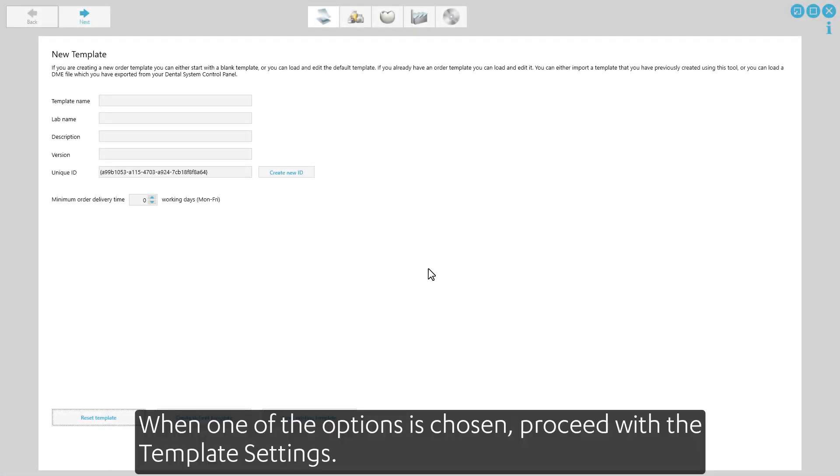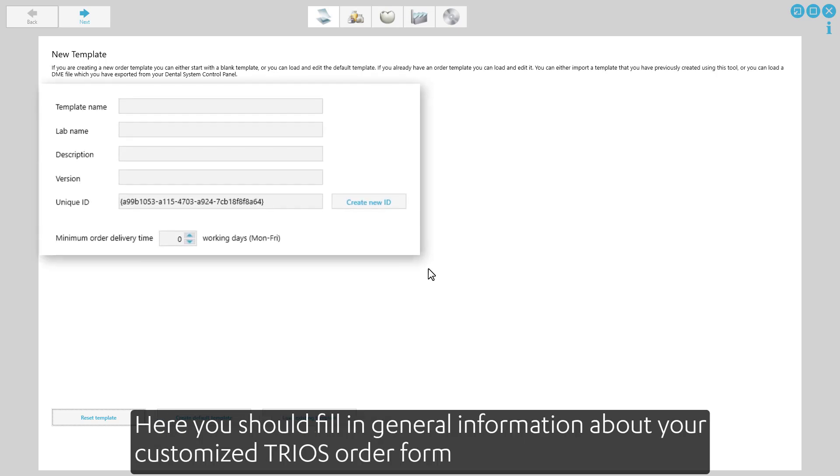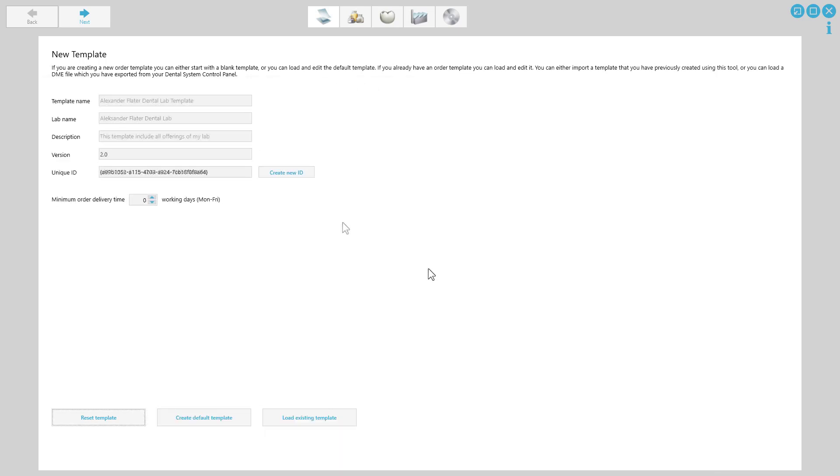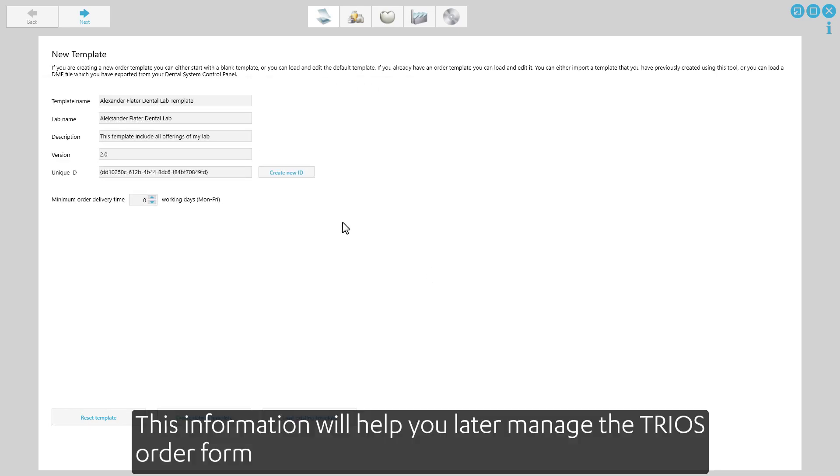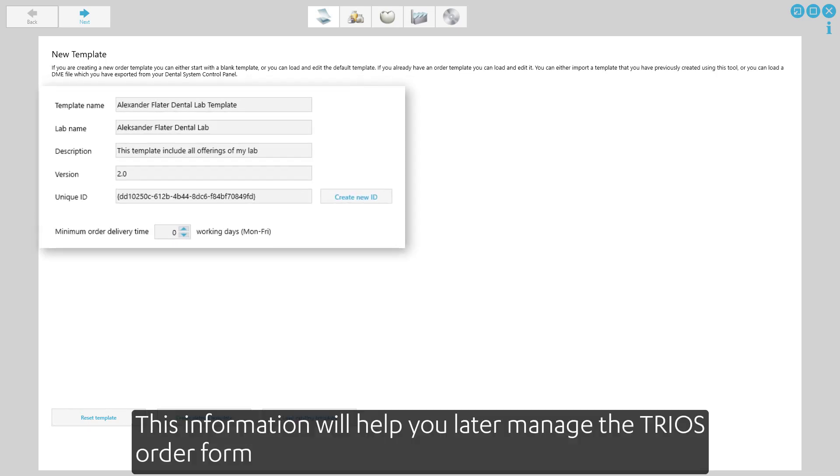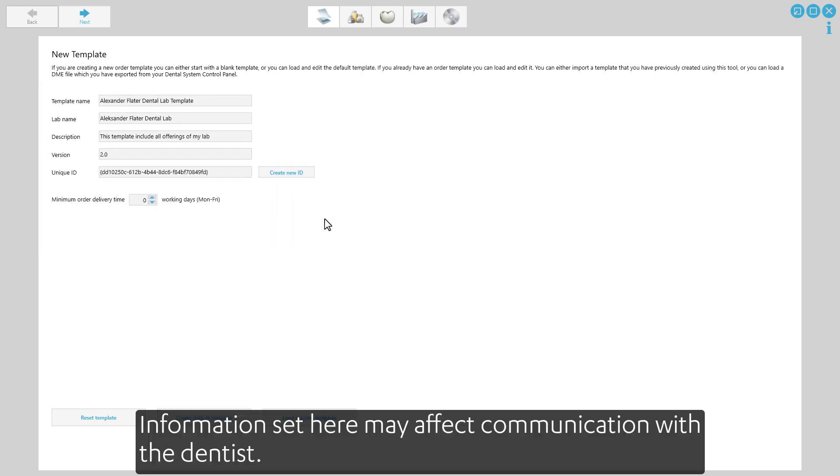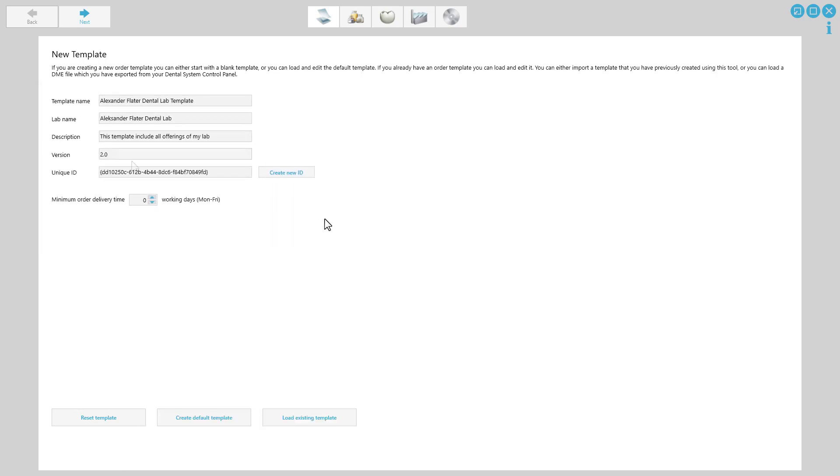When one of the options is chosen, proceed with the template settings. Here you should fill in the general information about your customized TRIOS order form. This information will help you to later manage the TRIOS order form. Information set here may affect communication with the dentist.